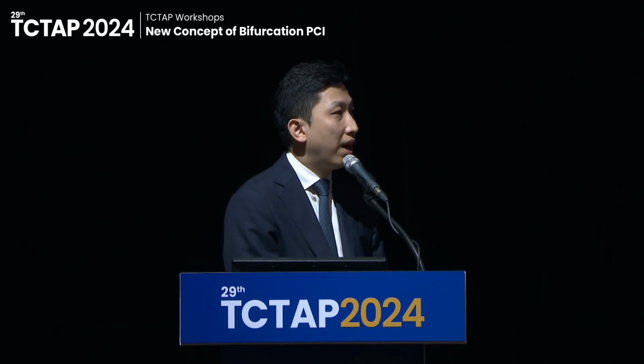For DK crush, I think it is a very good technique, with excellent data and excellent outcome. However, it's a little bit too time-consuming and too balloon-consuming. So we updated our mini crush technique with side branch optimization and further dilation of the side branch, and then we could get a good result with shorter time and lesser balloon consumption. So we are now doing our crush technique without DK. However, we would need some comparison data of our technique to DK crush, if feasible.